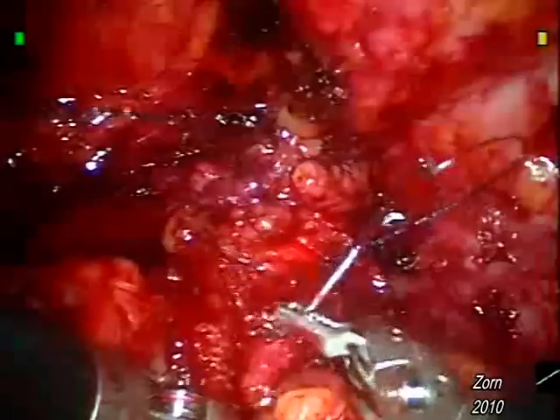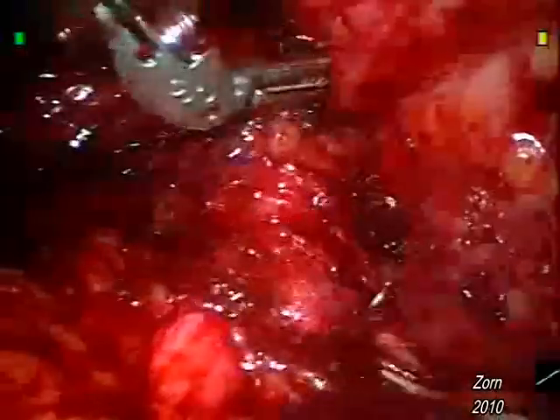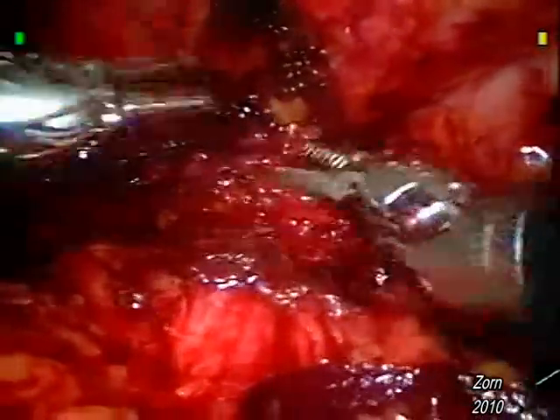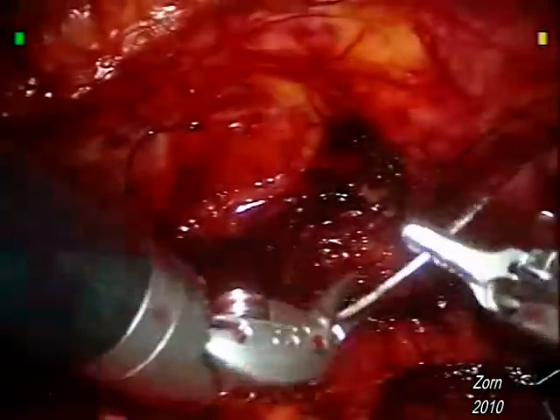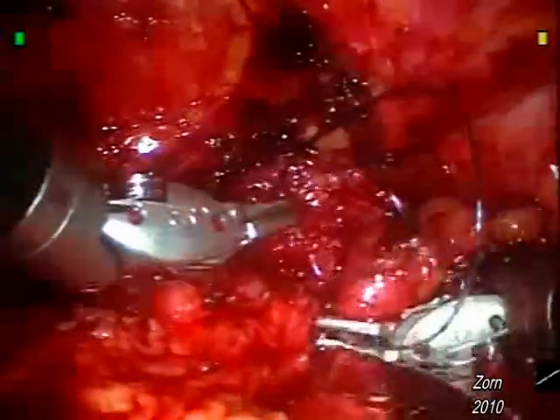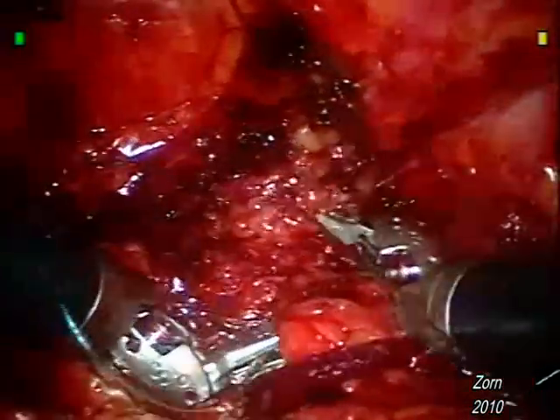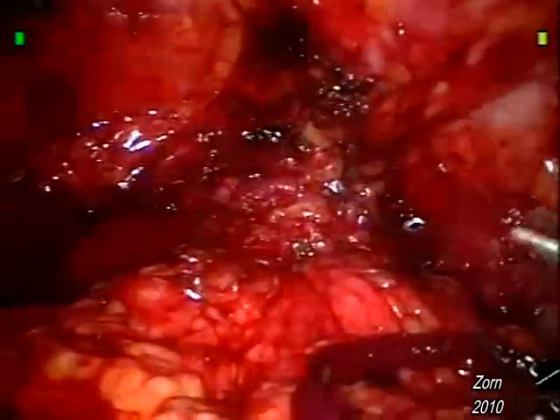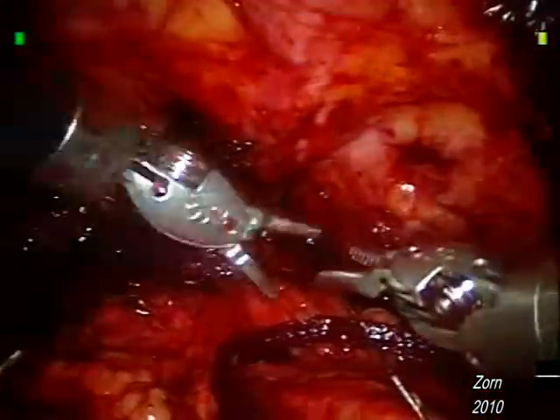Once this final anastomosis is complete, the surgeon observes whether or not the barbs were used up until the last two to three centimeters of the suture. Here, we have a considerable amount of space between the needle and the suture, so that there are barbs — as can be seen here — through the last bite on the tissue. It is for this reason that tying a knot or placing a lapar-tie clip is not required, though surgeon preference determines this.